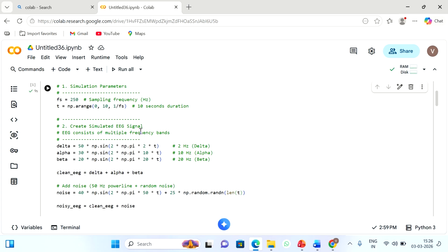That is why full, 100% conductivity we will not get. So the EEG amplitude will be very small in magnitude.